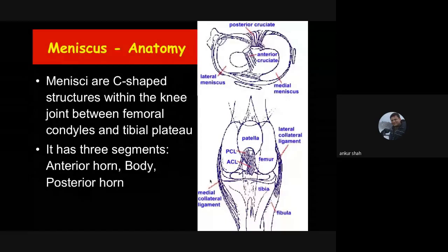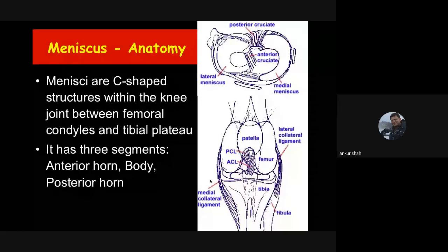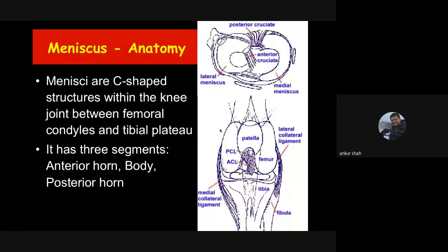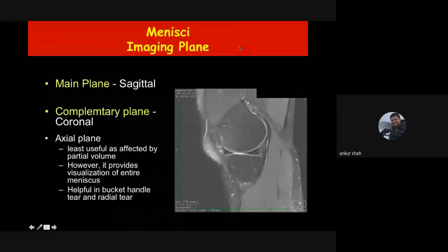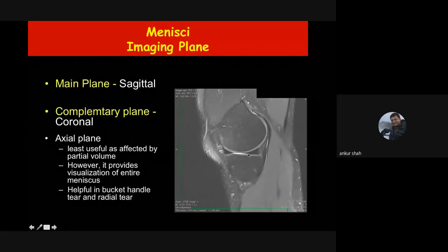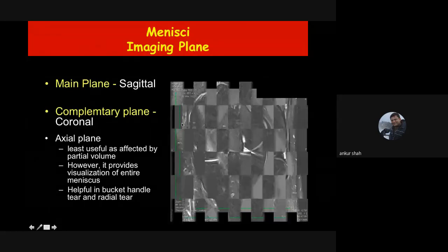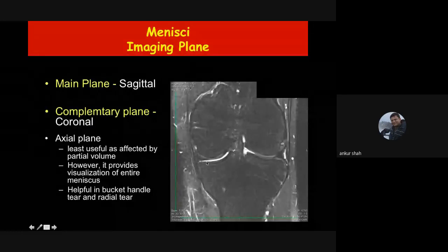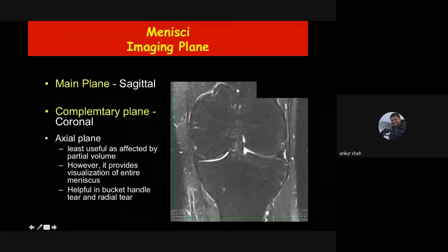Starting with the meniscus: the menisci are C-shaped structures within the knee joint between the femoral condyle and tibial plateau. Each has three segments — the anterior horn, the body, and the posterior horn. The main imaging plane for meniscus evaluation is the sagittal plane. The complementary plane is coronal — if you see any abnormality in the sagittal plane, check it in the coronal plane to confirm whether it is artifactual or actual.